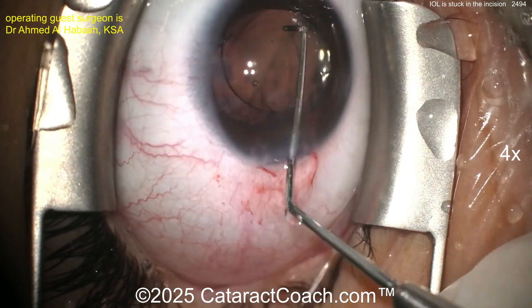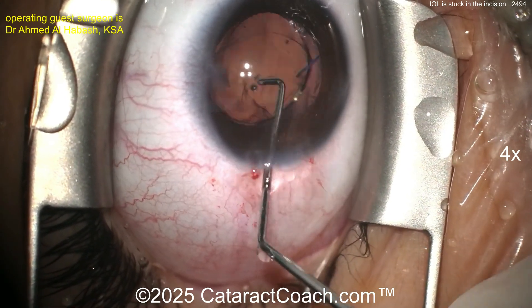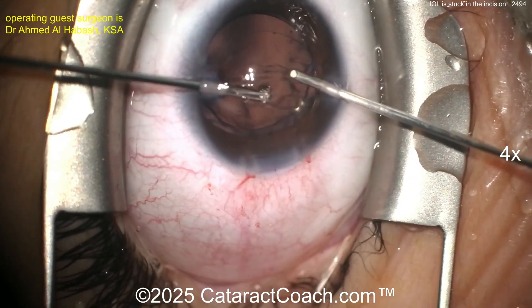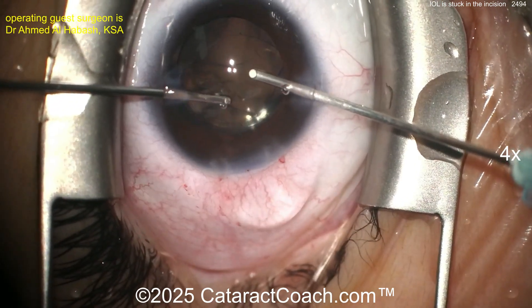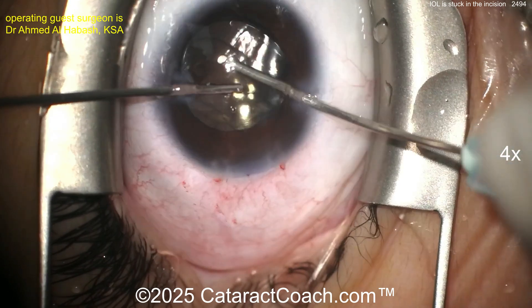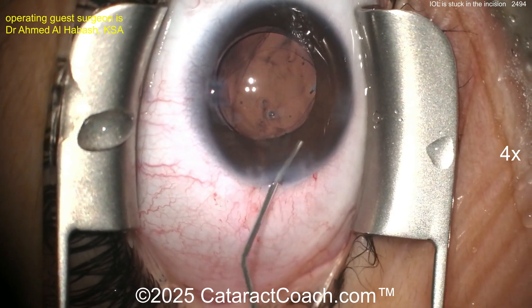The good news is the patient is not going to need a YAG capsulotomy. In retrospect we could have done things a little differently. There's the good optic capture — very nicely done. You can see the rhexis has become more of an oval shape. Now taking out the rest of the viscoelastic — be careful not to cause any turbulence. You don't want the lens tilted or vitreous brought up into the anterior chamber.